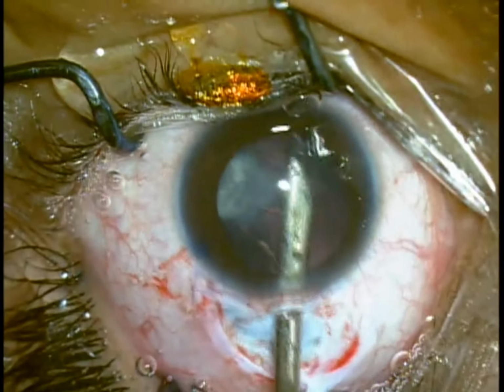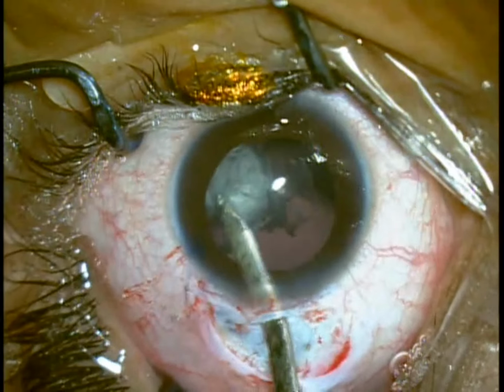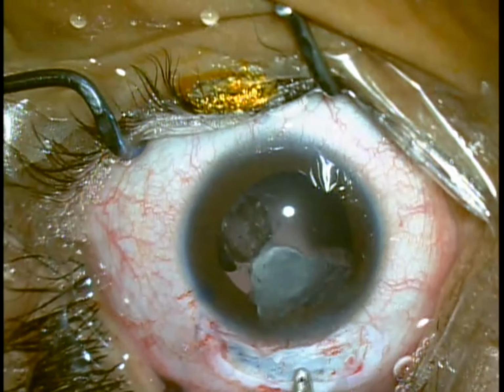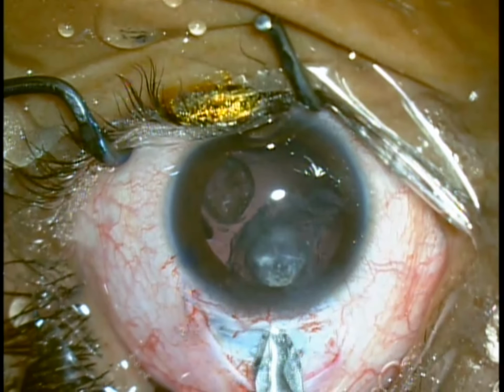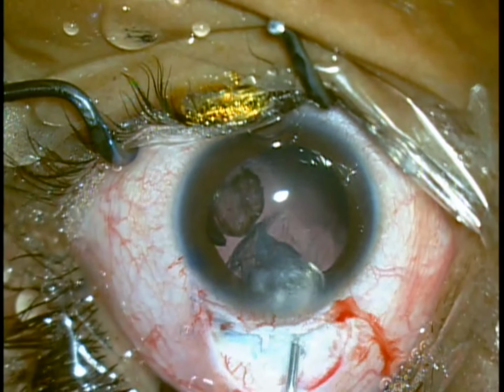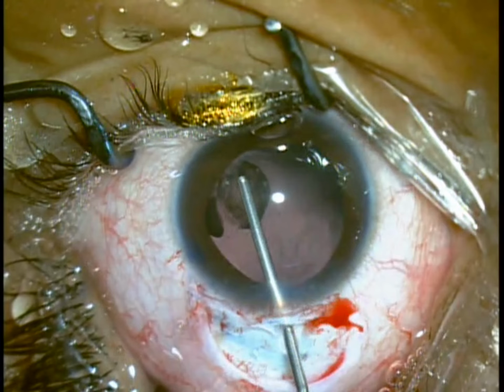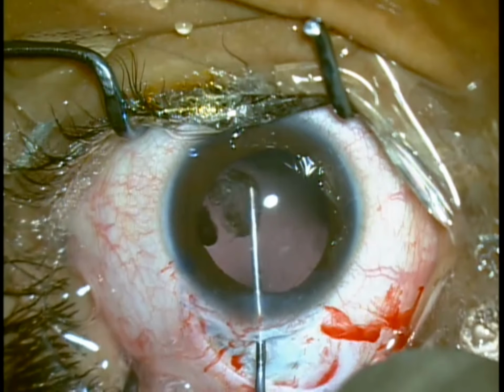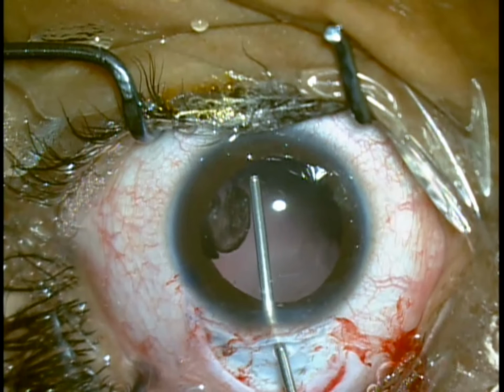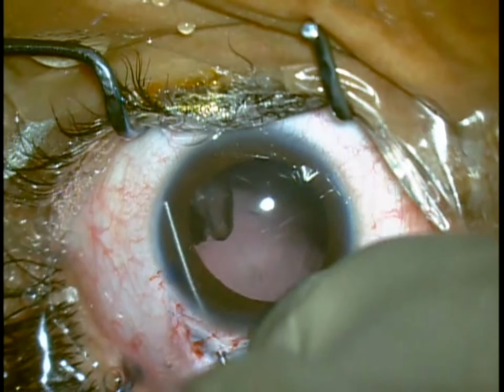Lens aspiration is done and the cataract is aspirated and removed without disturbing the posterior capsule or the cyst. Following the removal of the cataract, we can see a part of the cyst inferotemporally. The cyst is then inspected and it was found that the posterior capsule was intact over the lesion. The cystic lesion is seen to be moving in the vitreous.